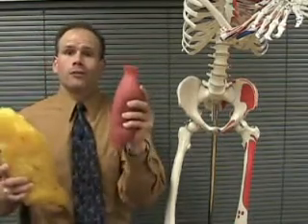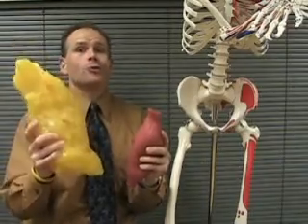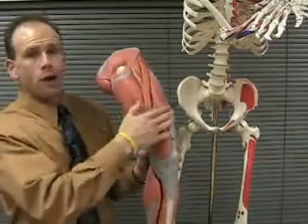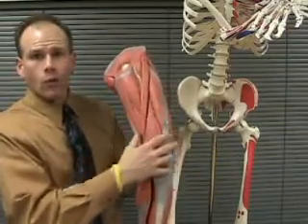Remember, previously we talked about the idea that we're going to try to pull the subcutaneous fat away from the muscle. Hopefully the subcutaneous fat measurement is not this large. We're going to need big calipers if that's the case. Trying to pull the subcutaneous fat away from the muscle so that we can measure the skin folds. Remember, the skin folds will be just above or superficial to all the musculature.